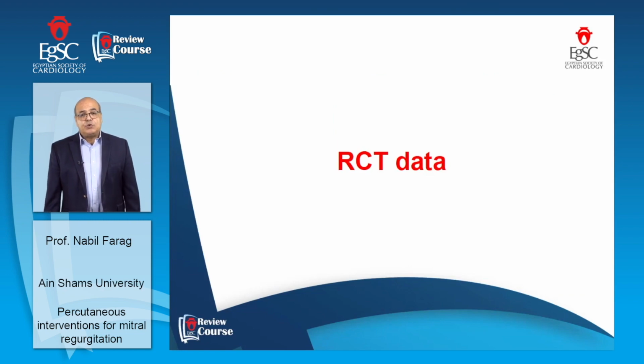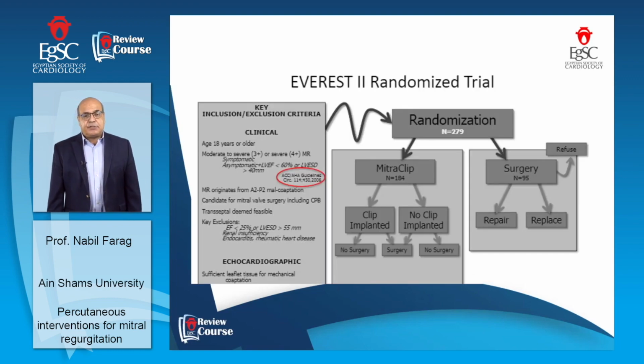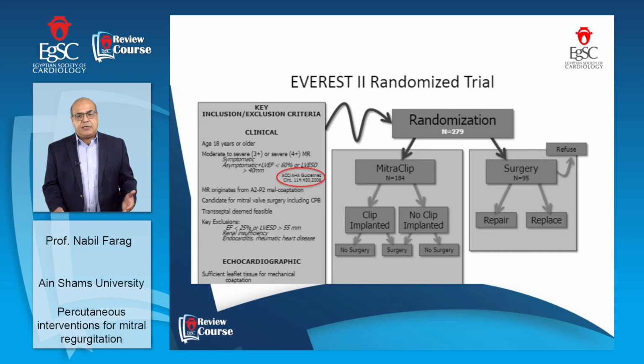It's very important to go through the randomized controlled trials and the randomized controlled data we have about this important new technique, which is mitral valve repair using the clip. We have the very famous trial, which is the EVEREST II randomized trial. I will not go through the inclusion criteria because we mentioned them before. They are clinical criteria and anatomical criteria.